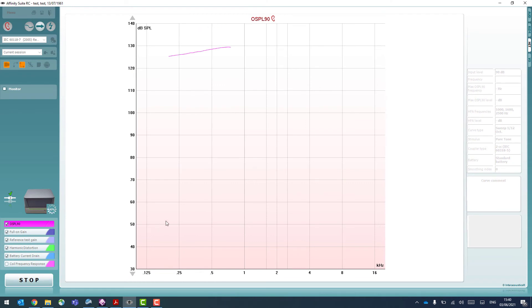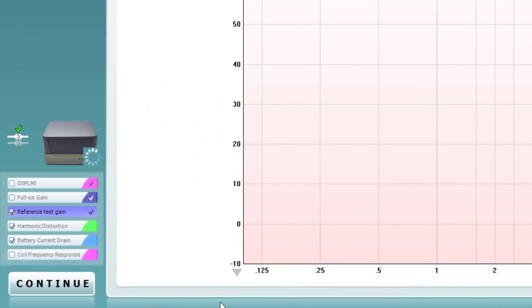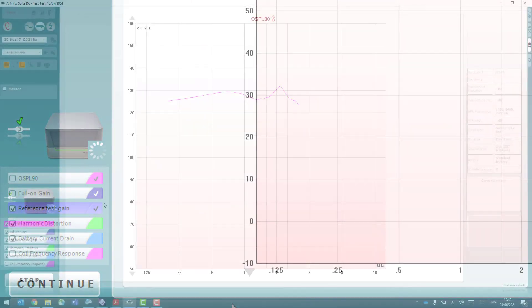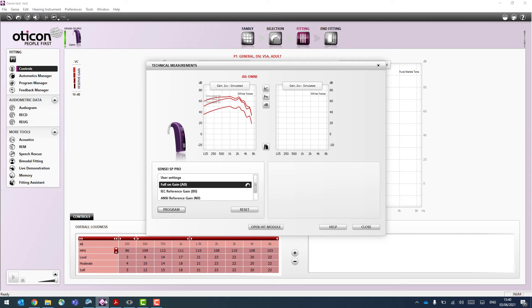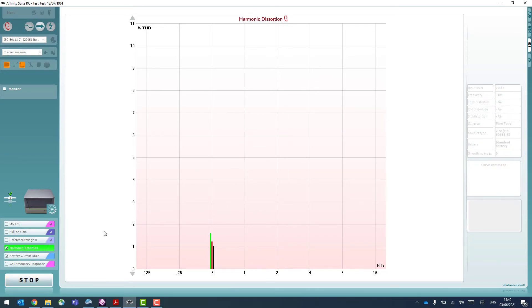I'll hit start. You can see that the system is drawing the curves. We now get to the reference test gain and it's prompting me to change that setting. In your hearing aid software you'll have settings for either IEC reference test gain or ANSI reference test gain. At this point you need to swap it to ANSI reference test gain to reflect the protocol we're running. Once programmed, we can go back to the software and hit continue to complete the rest of the test battery.